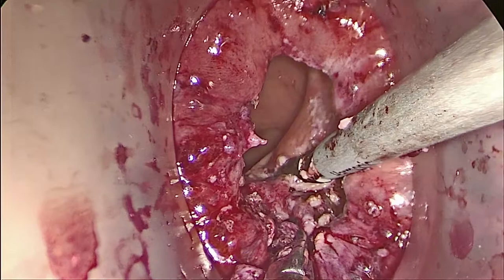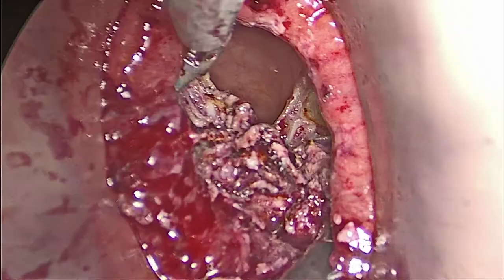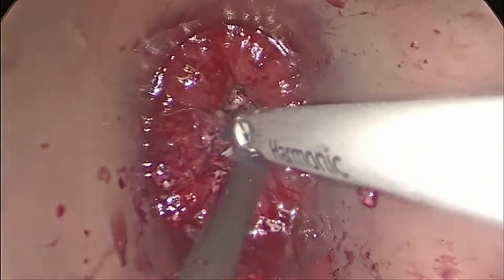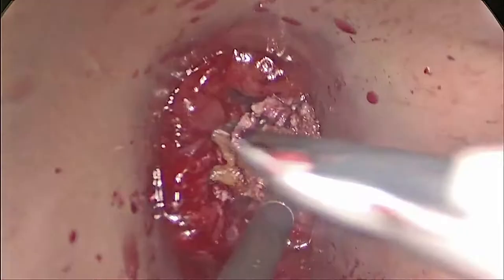For anterior tumors, great care must be taken not to produce prostate lesions that, especially in elderly patients, are increased in size with subsequent risk of bleeding and infection. Tractions should be performed on the healthy margins and the specimen should always be pulled as little as possible in order to avoid fractures. In this case, due to lesion position and exposure, it was necessary to pull the specimen several times, but all tractions were handled carefully and in the end the specimen was undamaged.